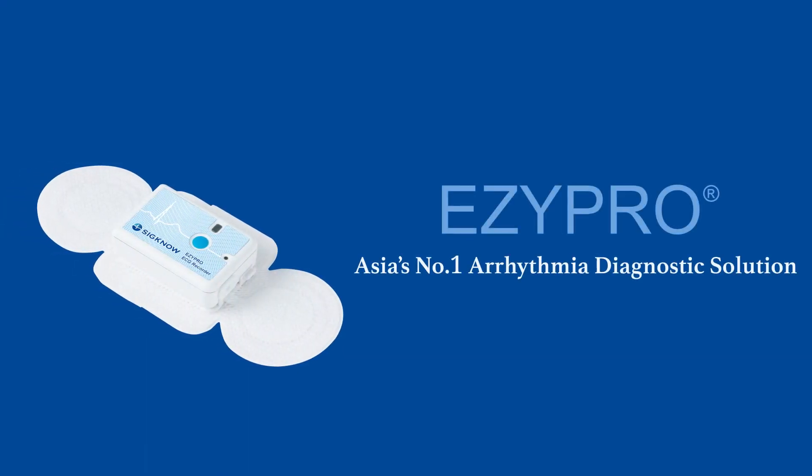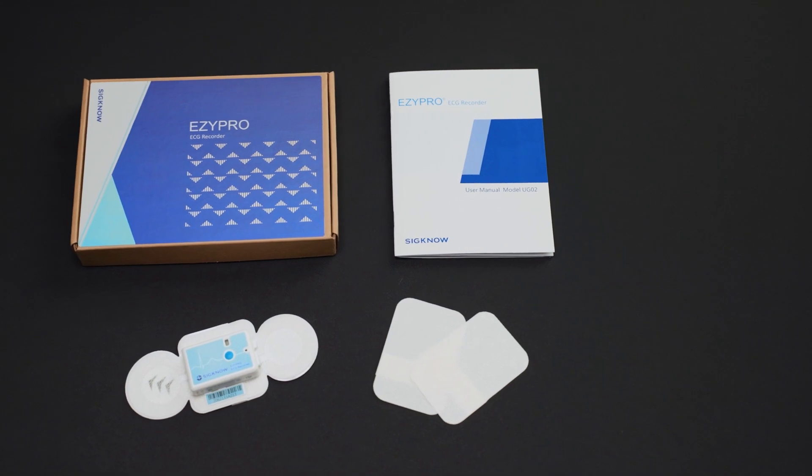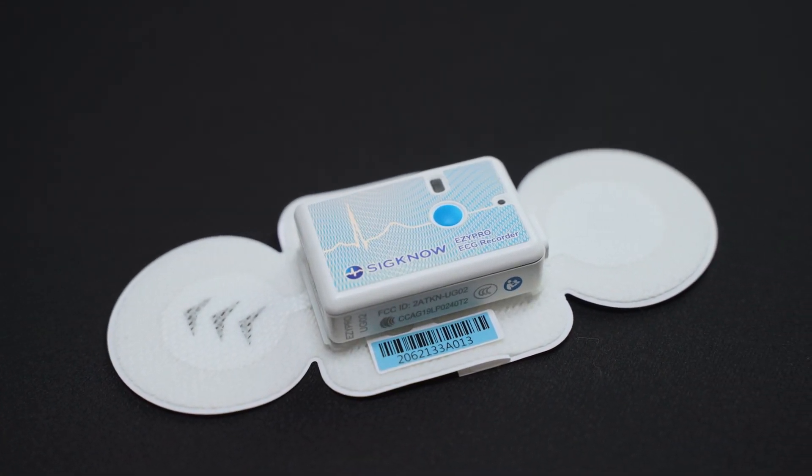This is EasyPro, Asia's number one arrhythmia diagnostic solution for cardiologists around the world. It is lightweight, cordless, waterproof, and can be worn by patients for up to 14 days without interfering with their daily lives. Today, I'm going to show you how to wear EasyPro.